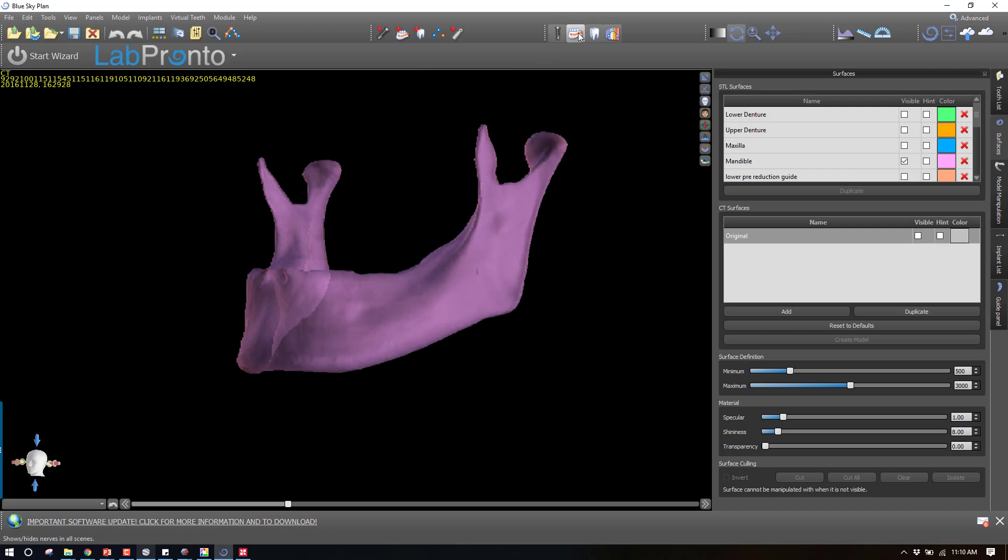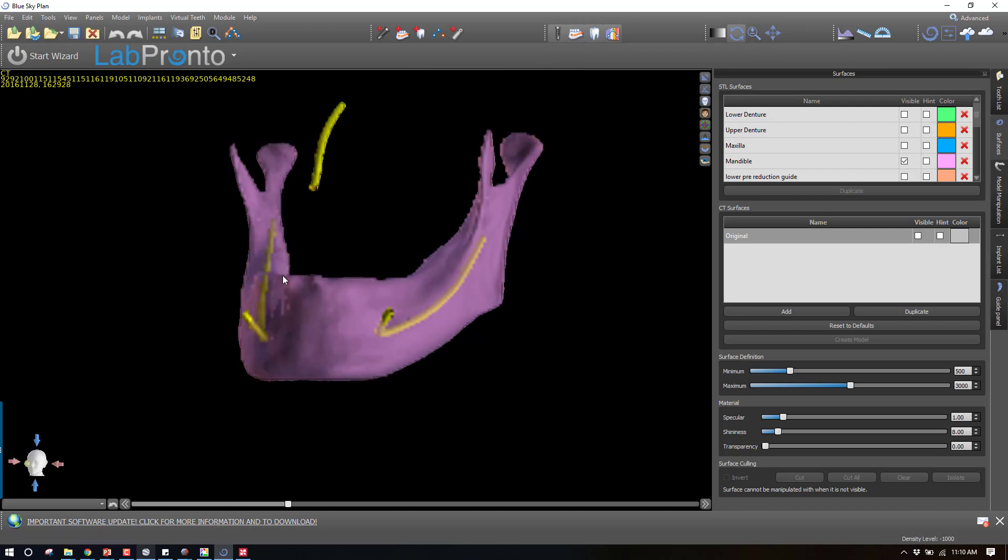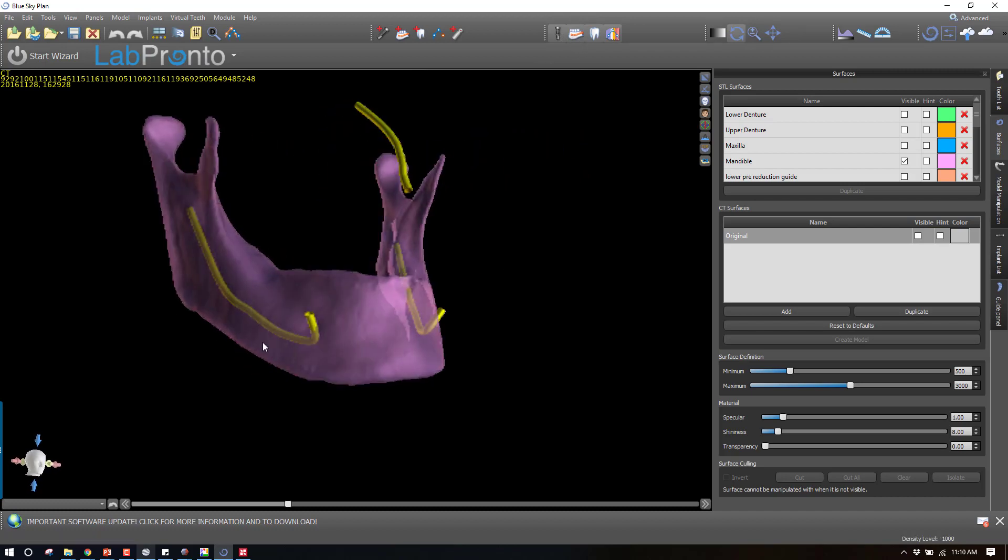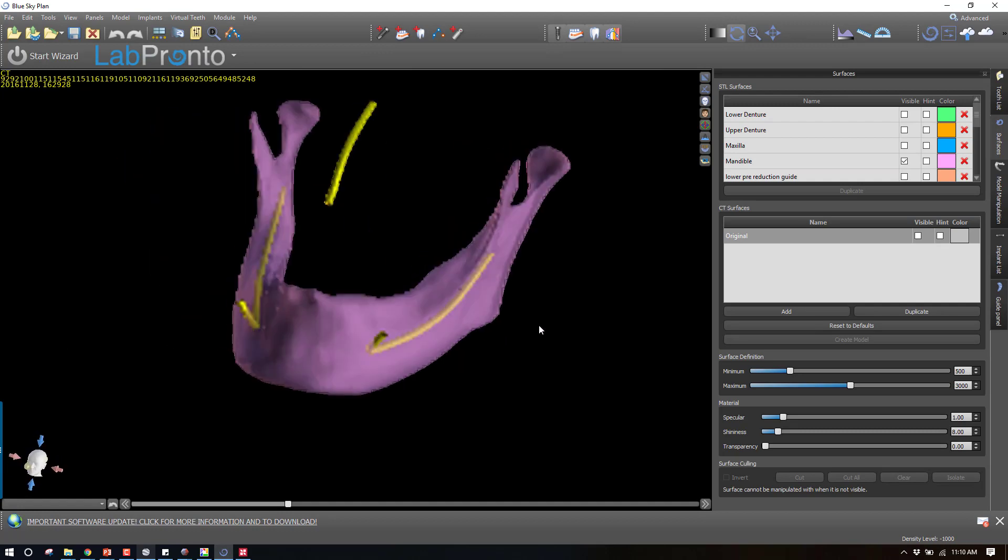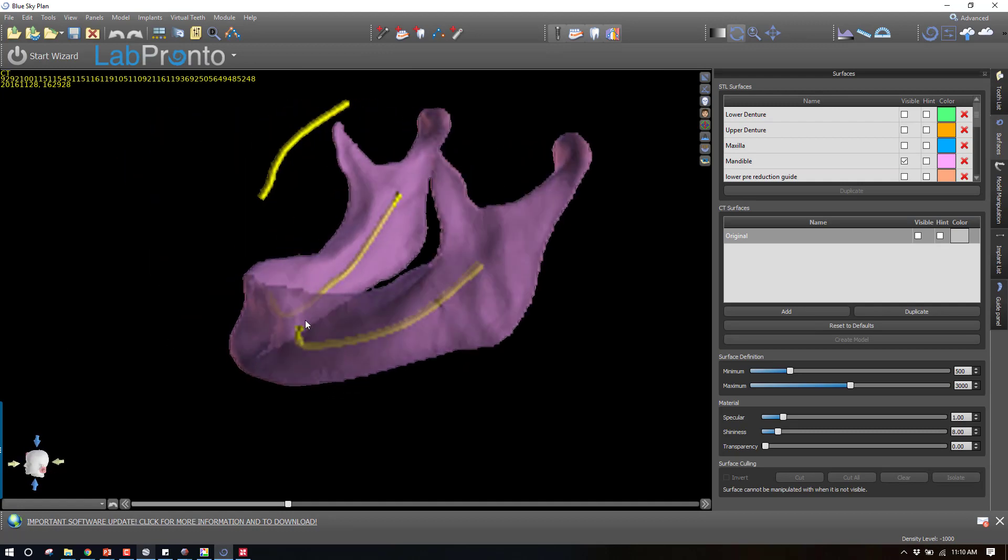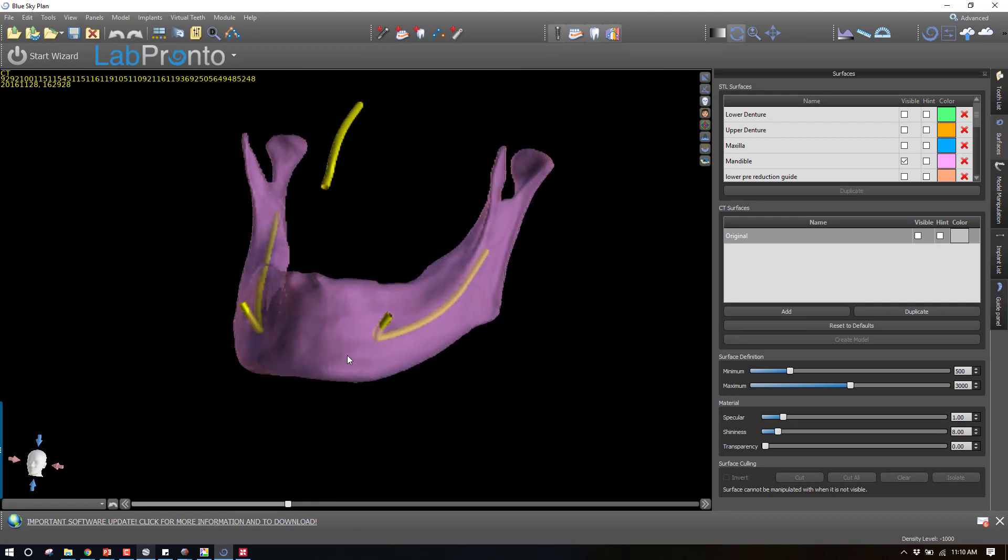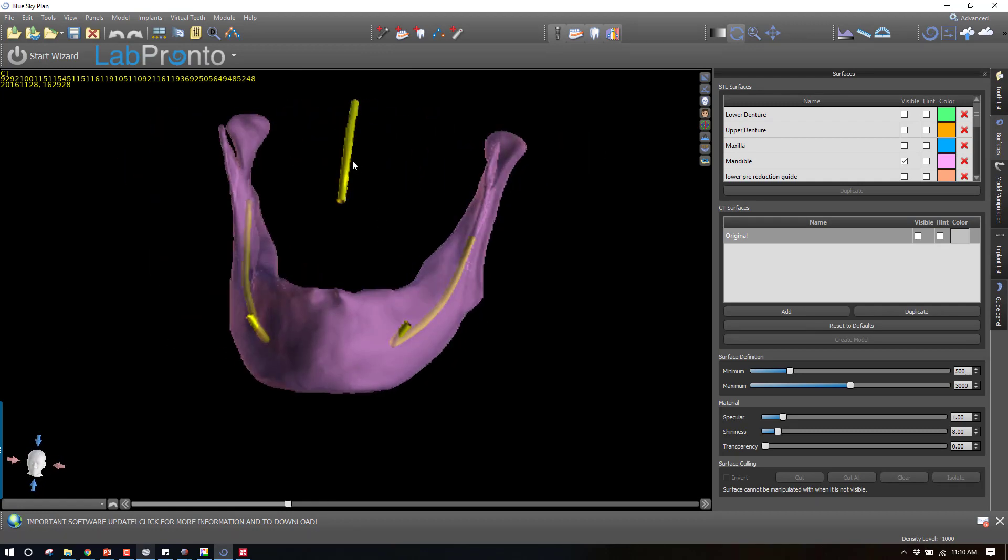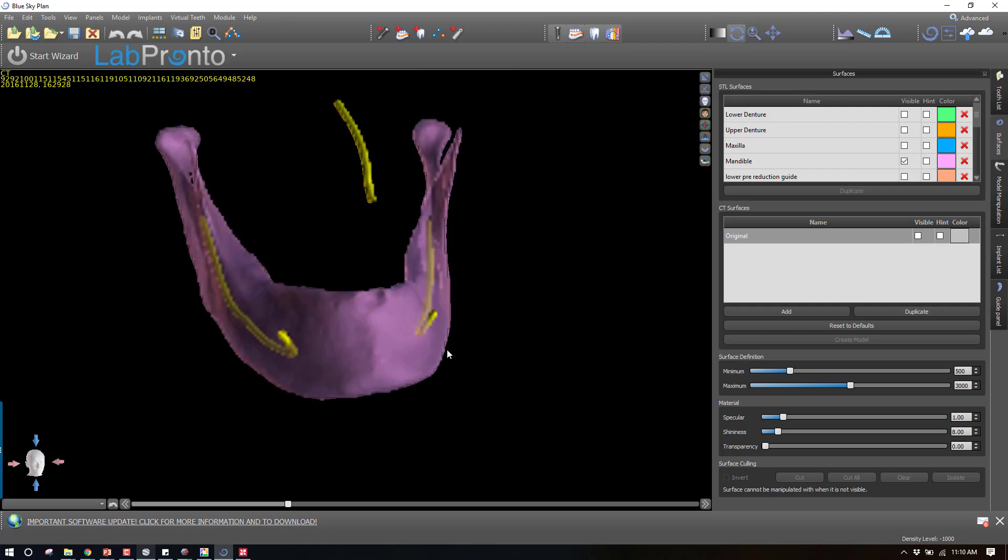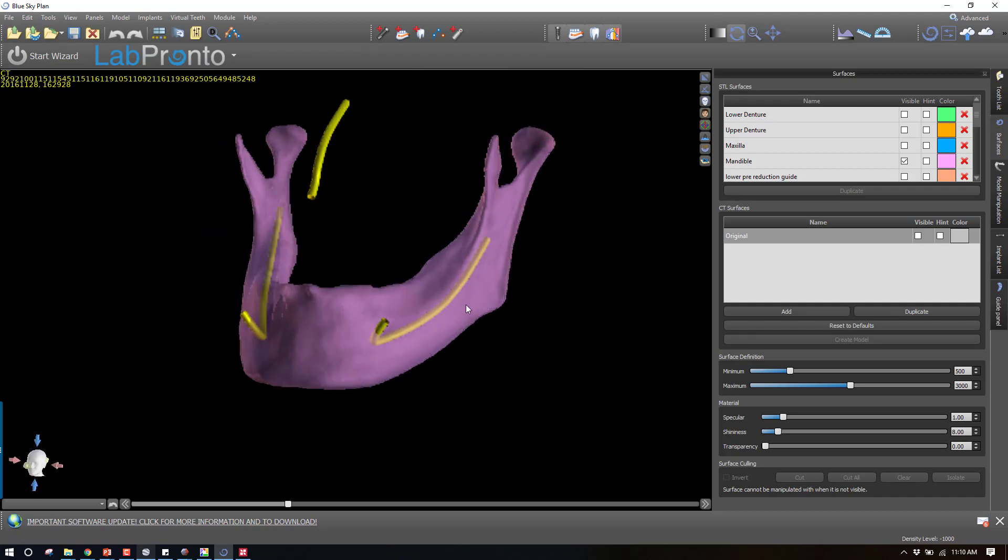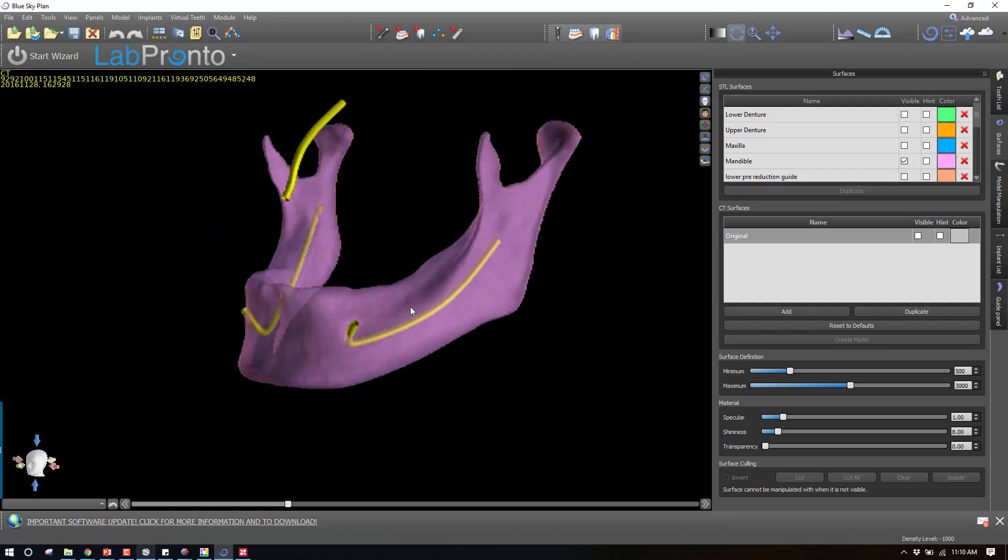What I've done now is also mapped the nerves. You can see I've got both of the mandibular nerves mapped. I even did an incisive canal up here for the maxilla. Once you've got those two pieces of information, you've correctly mapped the nerve, now you're ready to do the boolean subtraction.